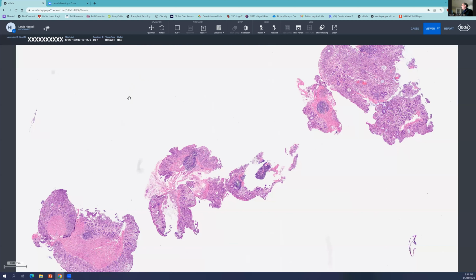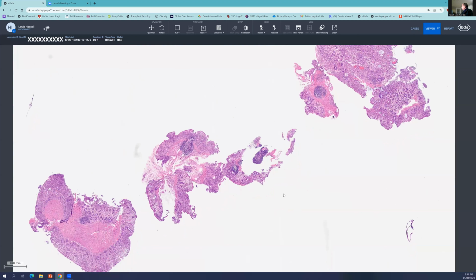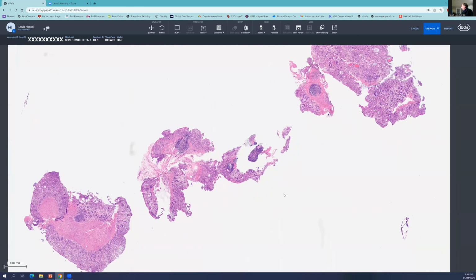Here we see what this patient's bowel biopsies looked like. You can see here a number of colonic biopsies. And on evaluation, the endoscopist said that the bowel appeared somewhat hyperemic. There was some oozing blood, but no focal lesions were identified.